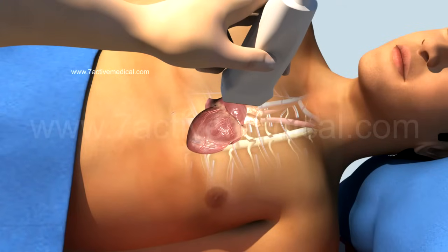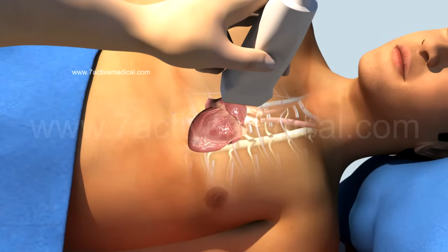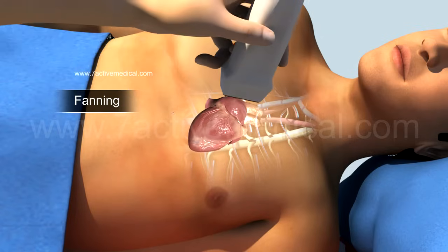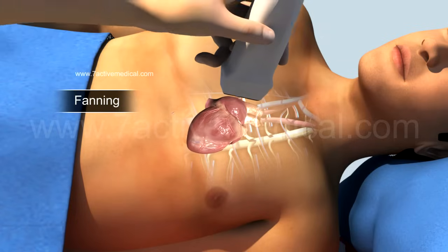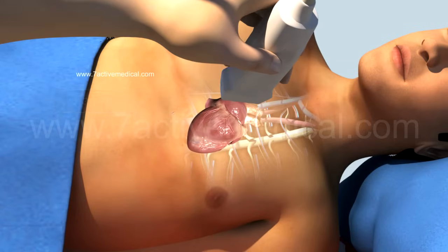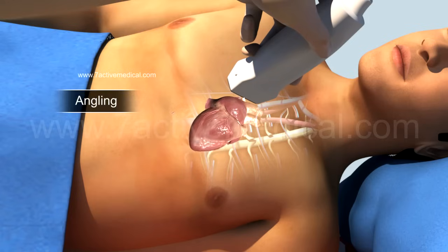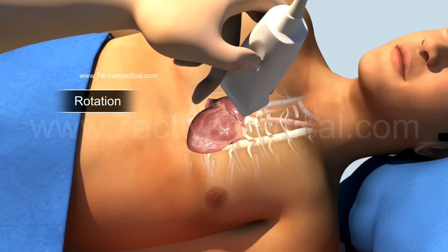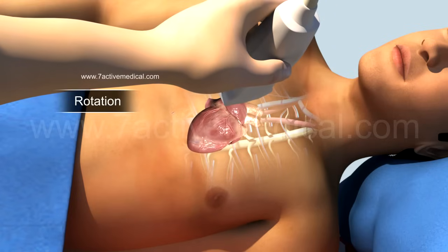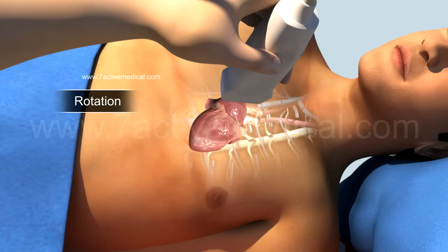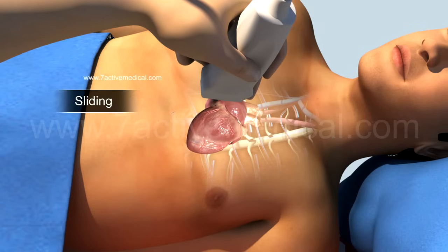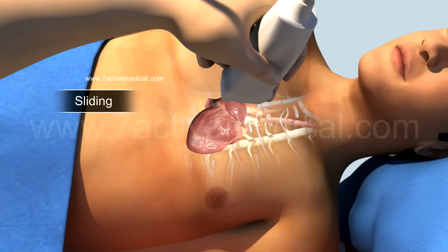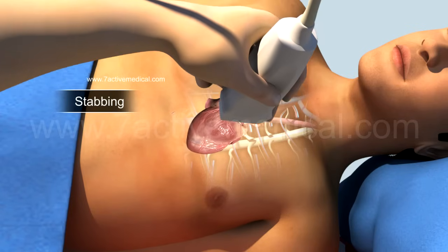Common maneuvers while doing a 2D echo include fanning from left to right, angling, rotation around a perpendicular axis, sliding, and stabbing.